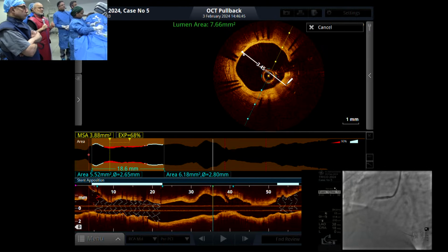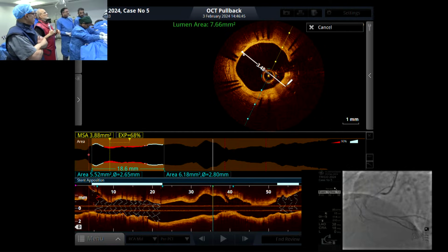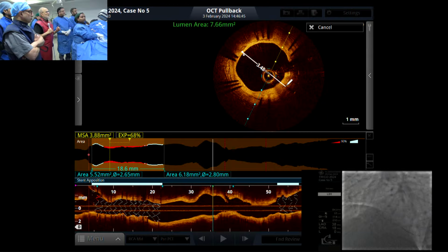The blood pressure, I think we need volume. Show the pericardial border. There's no problem, everything is fine. This was vasovagal.